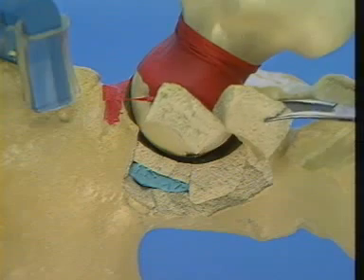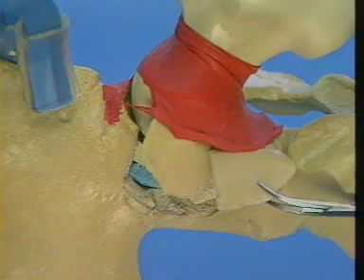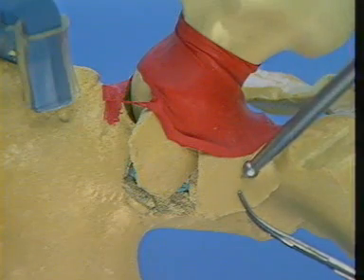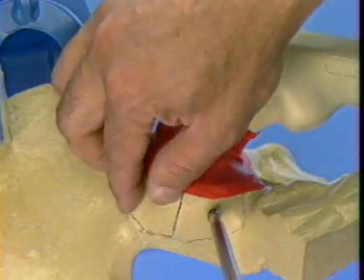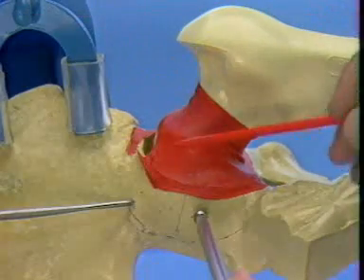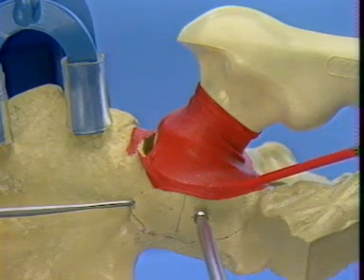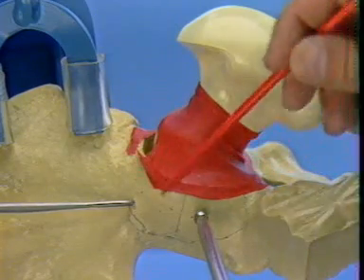The fragments of the posterior wall, which comprise a part of the retroacetabular surface, are now reduced into place. It's usually necessary to reduce both fragments simultaneously with one's finger and also with the help of the ball spike. A periosteal elevator can also be used. A lag screw is placed into each fragment near the rim of the acetabulum. The screws must leave adequate room for the plate, which will span the fragments.